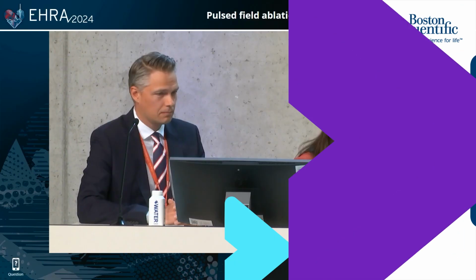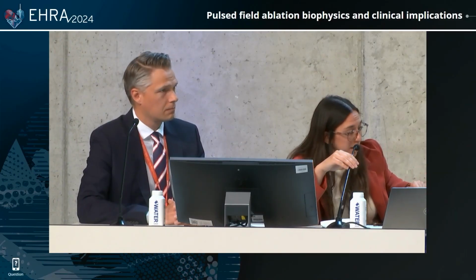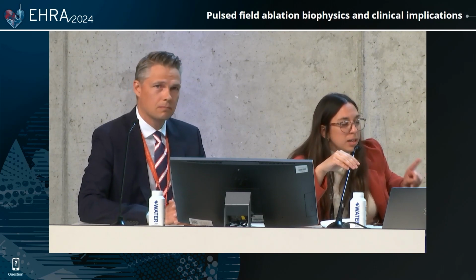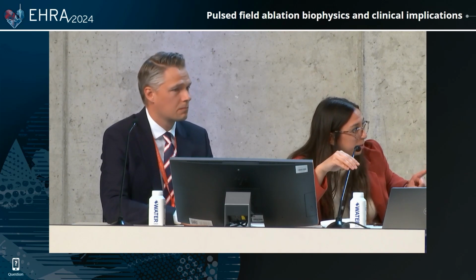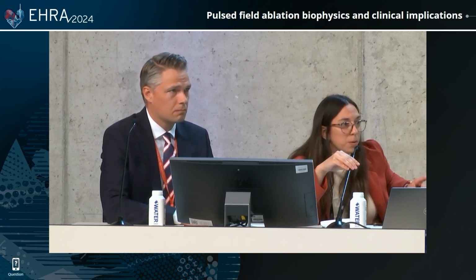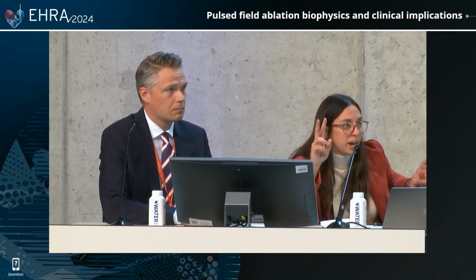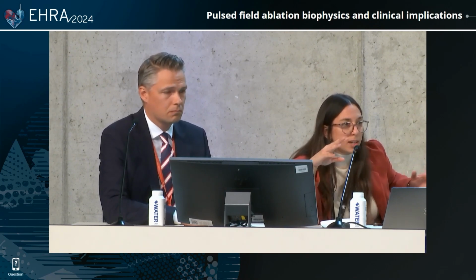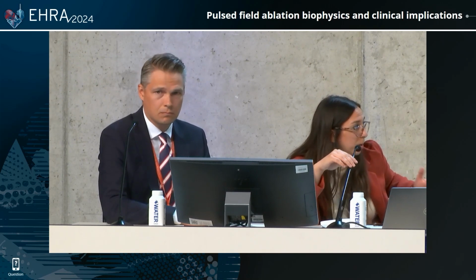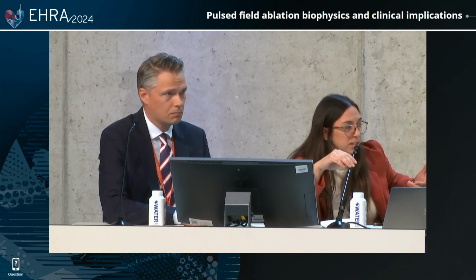It is on us to believe or not to believe, and it is always easier to believe when there is some data. And I think for this FIRE AND ICE... for this FirePulse technology, we have acute and remapping data after 3 months, right? So we know that this has been investigated, and they came out with the protocol of 8 lesions. With other technologies, we are a bit more in the dark. It is not mandatory to always do remapping. Some do it, some don't.